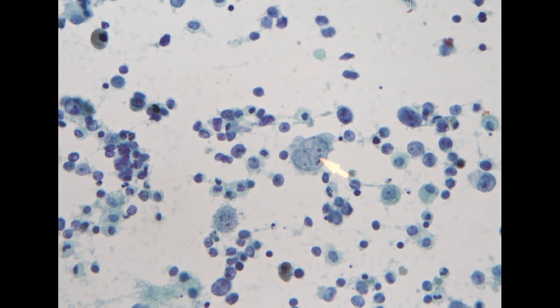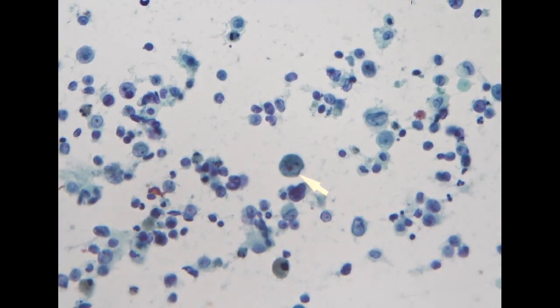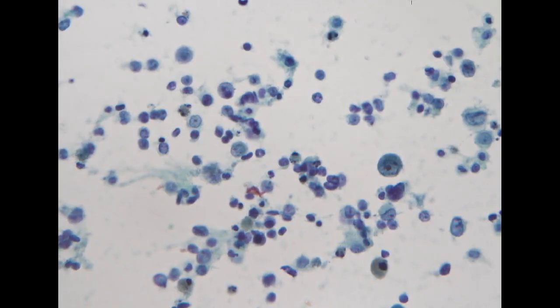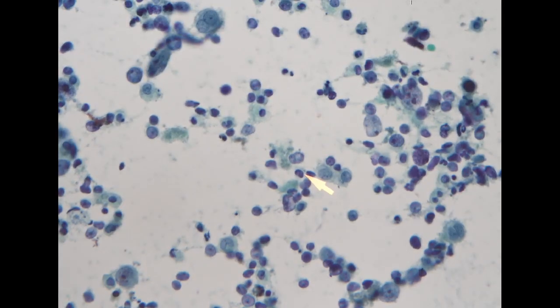However, in the background, there are also some bigger cells with more hyperchromasia and with occasional nucleoli. And then we pay attention to these, which should be reactive cells. I think in the background there are still some medium-sized cells that also look quite atypical.